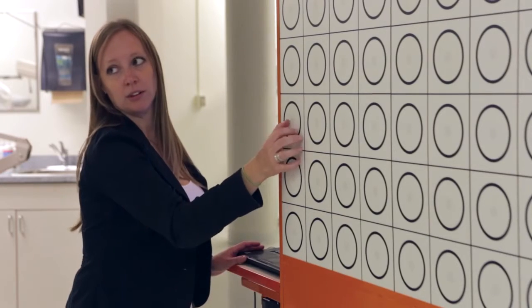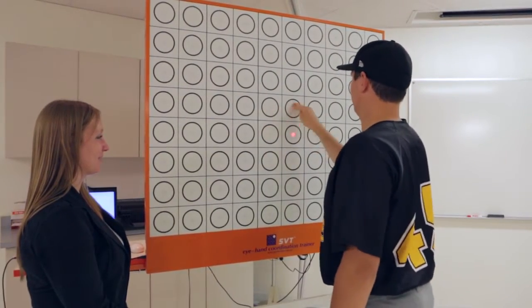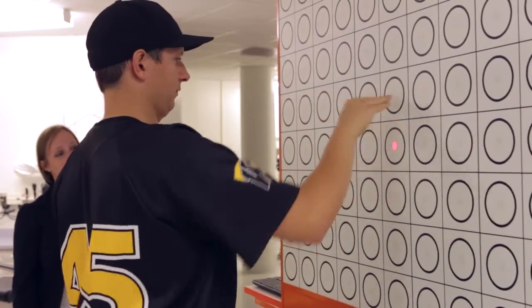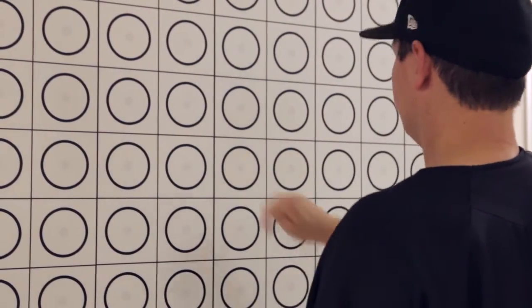We use an SVT, or sports vision trainer, which is a large board with a number of different lights on it in a grid pattern. With those lights, we can program different types of patterns, whether they're things like tips or deflections or different patterns to mimic peripheral vision tasks or central vision tasks.